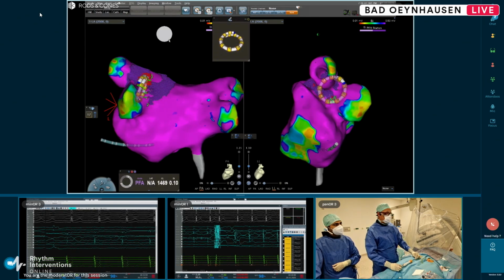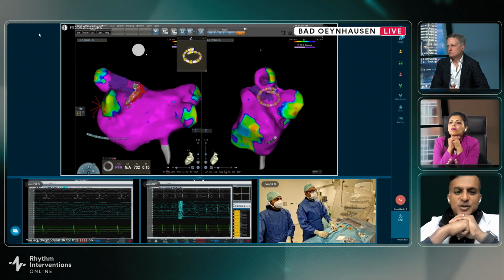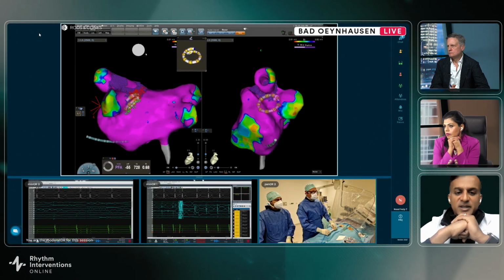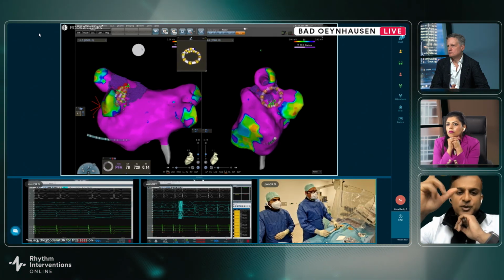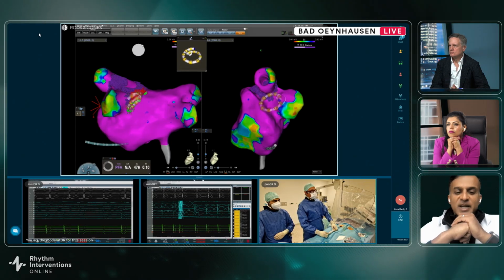And just a reminder, for the second application, the rotation is to cover up the lack of energy being delivered between electrode 1 and electrode 10, which gives a gap. And that's right. So that's what you're doing, correct? The rotation is to allow for energy delivery in that gap.